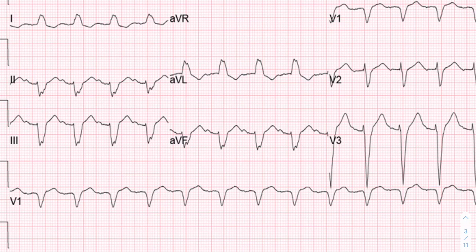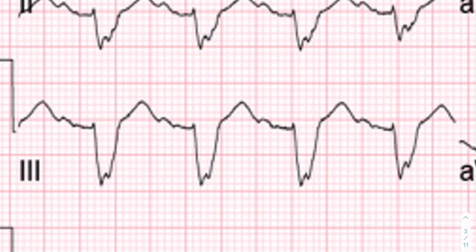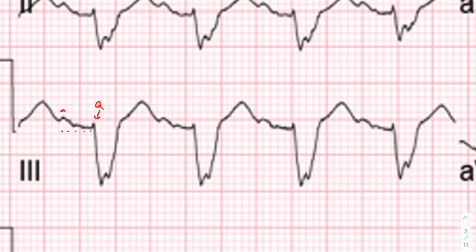Next, we'll look at our QRS complexes. I'll actually skip ahead to the PR interval. We have to find a good PR interval — zooming in, this is our P wave here, and this is the beginning of the Q wave. Counting the small boxes between them: one, two, three, four, five — which puts our PR interval at about 200 milliseconds, within the normal range of less than five small boxes.